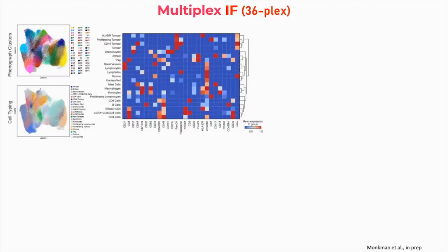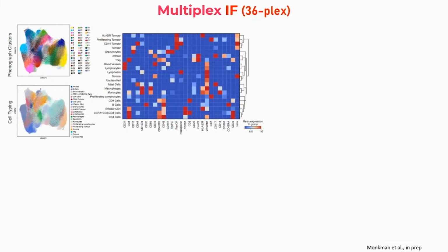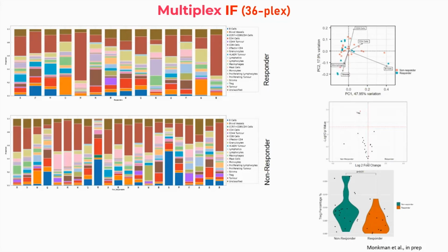And so we followed this up with a 36-plex assay to resolve this down a bit better. This work is in prep and should be submitted quite soon. Based on 35 markers, we could characterize multiple additional cell types within the tumor microenvironment of this tissue microarray, where each column represents an individual core, and this is just breaking it down between patients that responded to therapy versus those that didn't. And we could see an increased presence of Tregs, specifically in the non-response group.